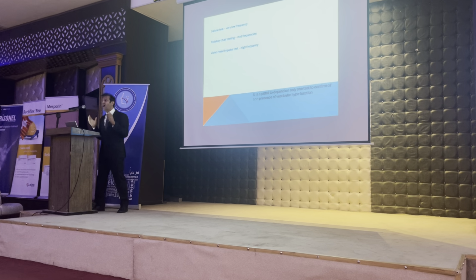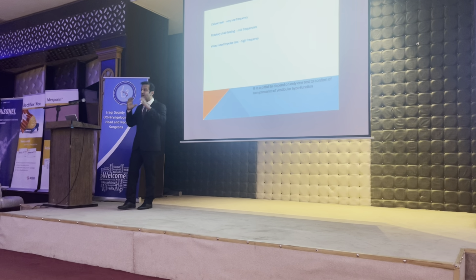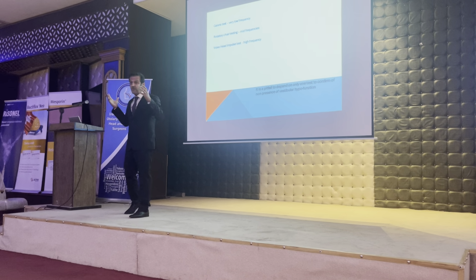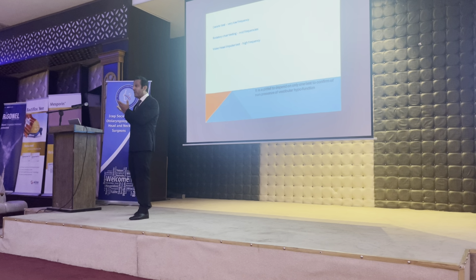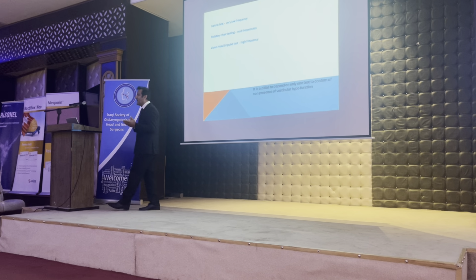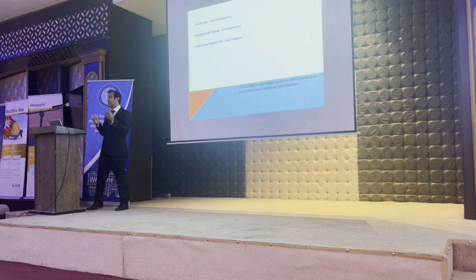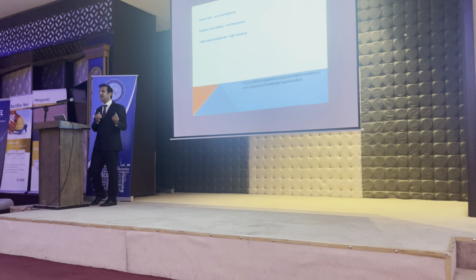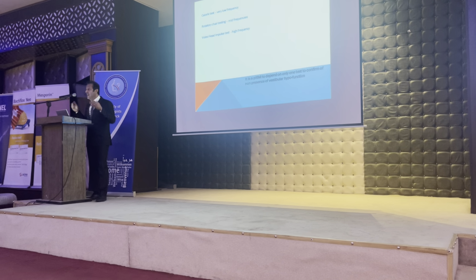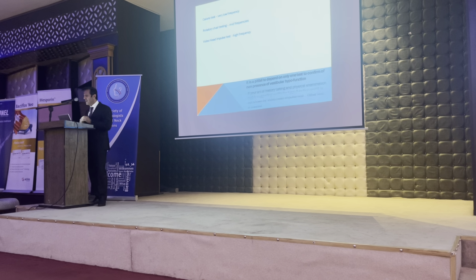Now, if your history taking and physical examination show that there is vestibular hypofunction and you get a negative head impulse test, you should proceed to other tests to confirm the presence of vestibular hypofunction in other frequencies, because probably the head impulse test is negative but the caloric would be positive. So there is a role for the caloric in very infrequent cases.